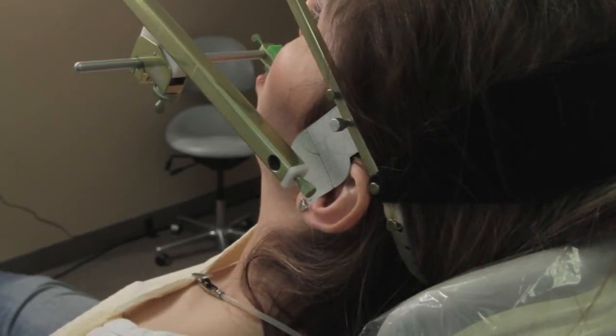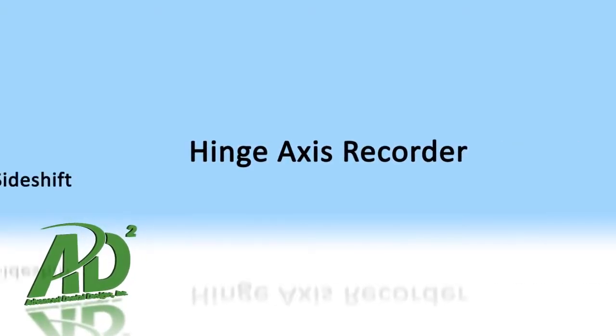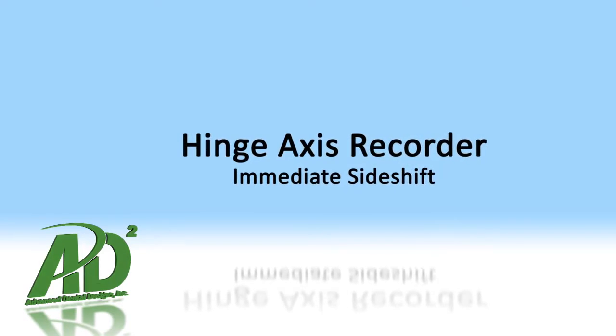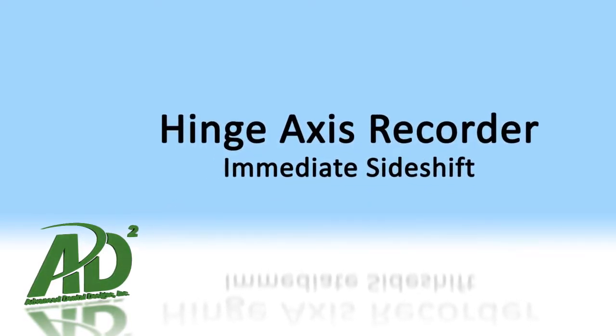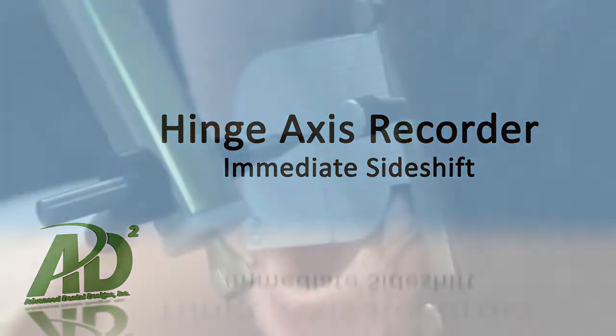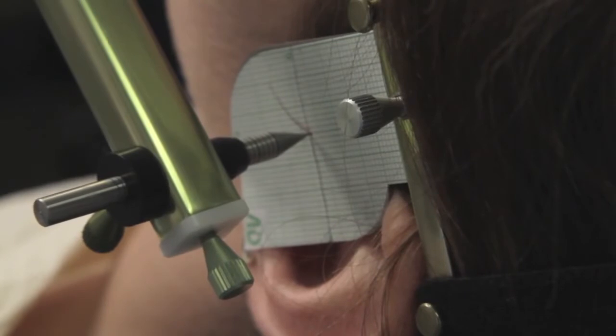Now we've got the axis orbital plane in all our recording on the flag assembly. We're going to measure the immediate side shift now. I've already measured the immediate side shift on the right side, so we're going to demonstrate it on the left side so that the camera can pick it up very clearly. There are 2 or 3 things that we have to consider in doing this.